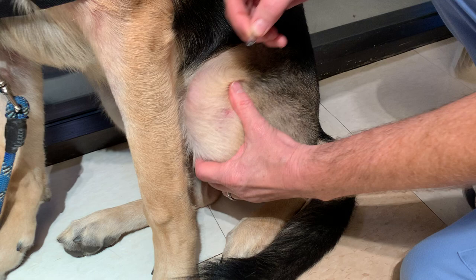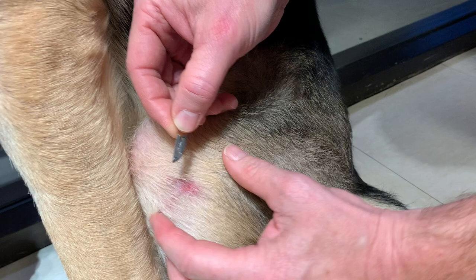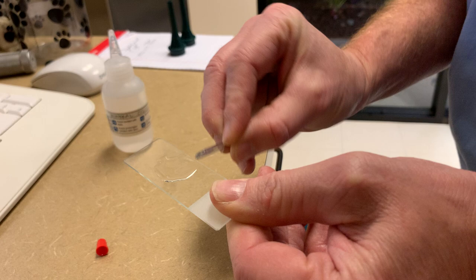We're collecting the superficial material for the superficial skin scraping over a broad area. You're not going to see too much on the slide, just a little bit there on the scalpel blade. Scrape it off on the edge and mix it around into the middle, then repeat that several times to get a superficial skin scraping.